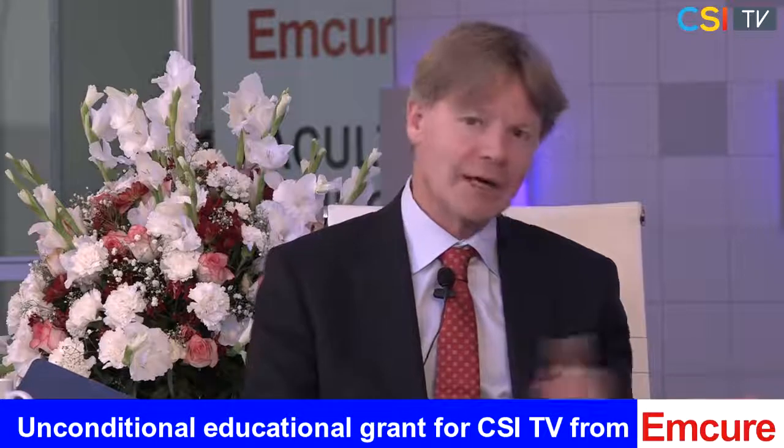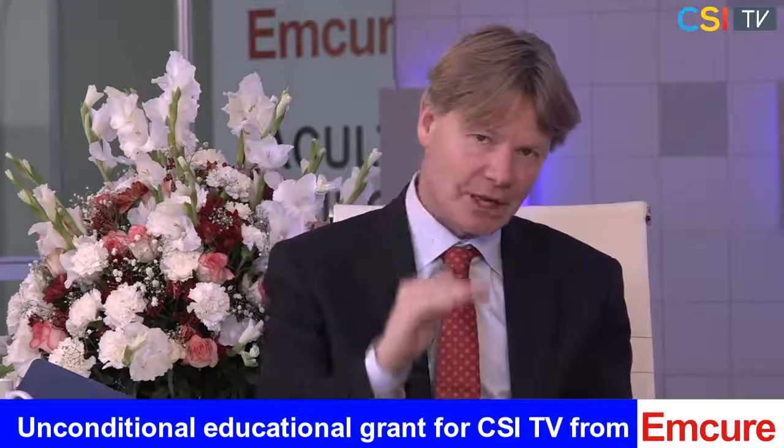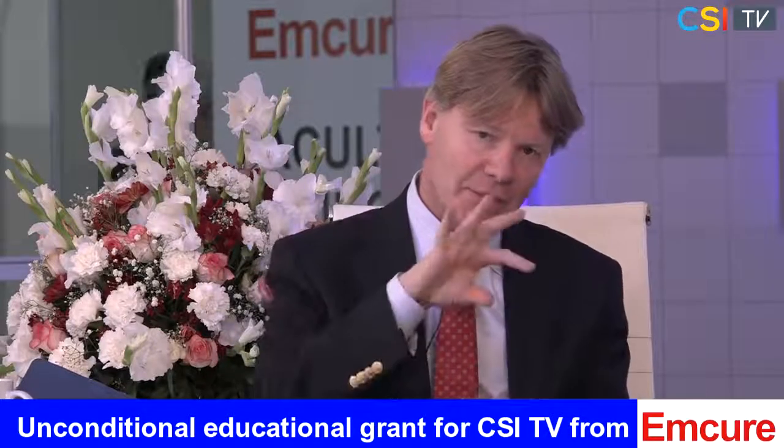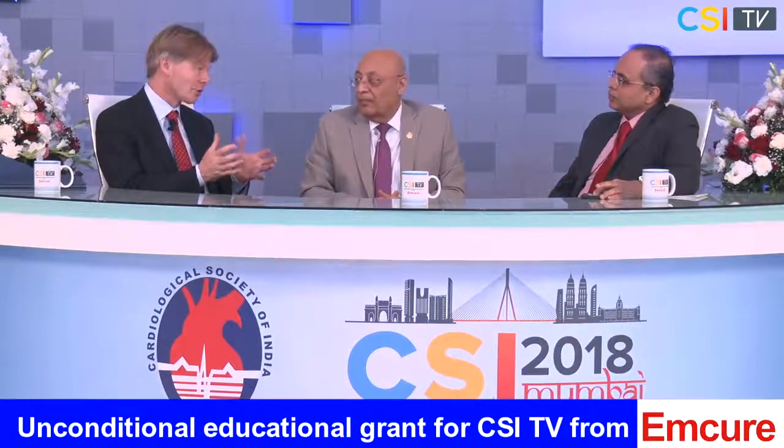But as you rightly point out, there are two other forms of strain. One is the inward strain, which is what we call the radial strain, and one is the rotational strain, which is called the circumferential strain. So for the complete picture of a heart, like Torrance Guasp already indicated, we need to look at the up and down, the inwards, and bring it together with the deformation in the circumferential region. If you want to have eventually the full picture of what a ventricle is doing, you need to combine those three. For the moment, for convenience, we're just starting with the longitudinal global strain.